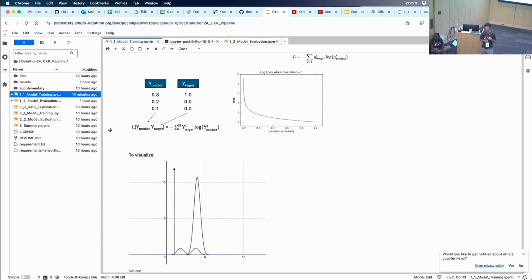So going back to your question, you asked how many epochs do you need? I would imagine that as you increase epochs, you would have less loss, a smaller number. Yeah. And I guess there probably is a point where it would plateau and it doesn't get better. So I think that would depend on at what point you see that plateau.